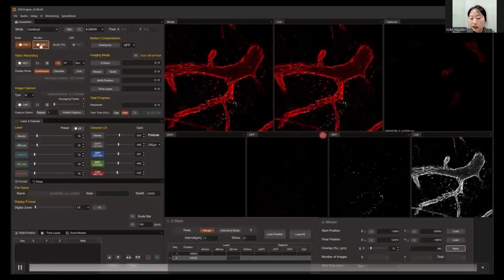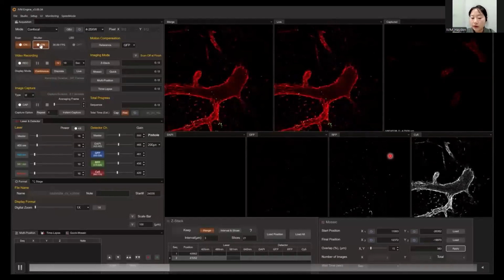In this experiment, the red signals represent blood vessels labeled with anti-CD31 antibody conjugated with the fluorophore from the Cy5 channel. And the green signals represent the fluorescent particles. We can observe the green labeled particles in action as they flow inside of the endothelial surface or firmly adhere to the blood vessel with some sense of purpose. With each observation, we inch closer to unlocking the secret of vascular endothelial dynamics and the delicate balance between drug response and circulatory function.